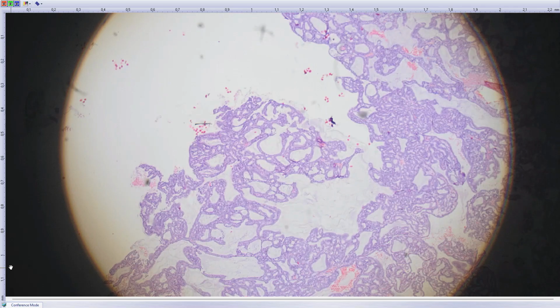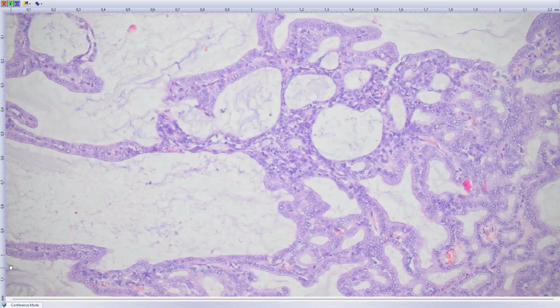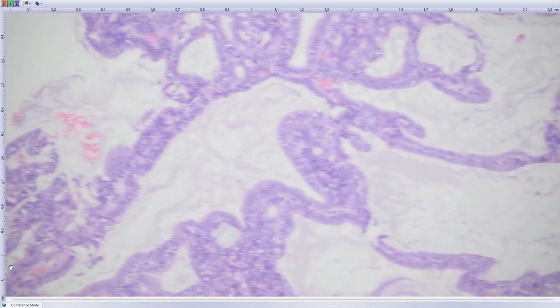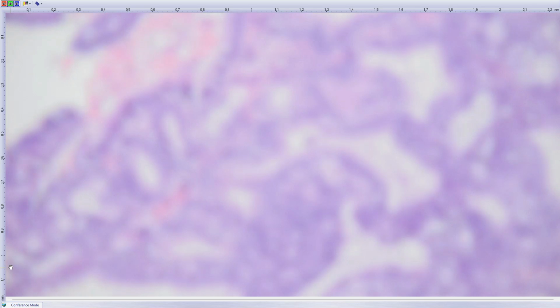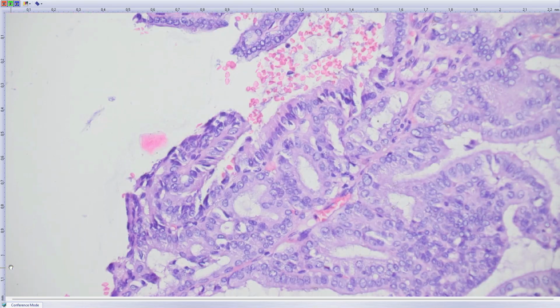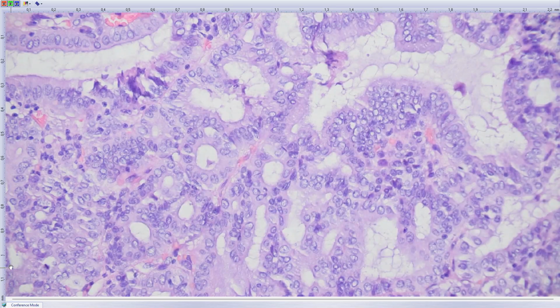You can see this gland-like polypoid proliferation, which is composed of not very atypical cells having this eosinophilic, sometimes ground glass cytoplasm. No or not many mitotic figures were present. Any diagnosis from our residents?